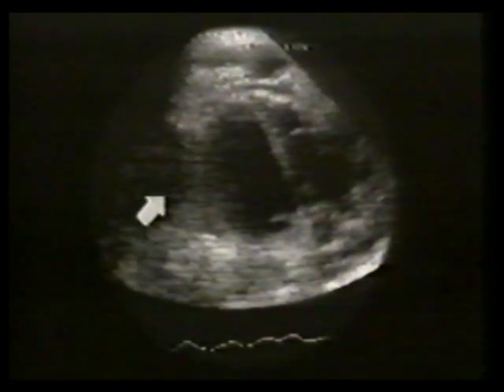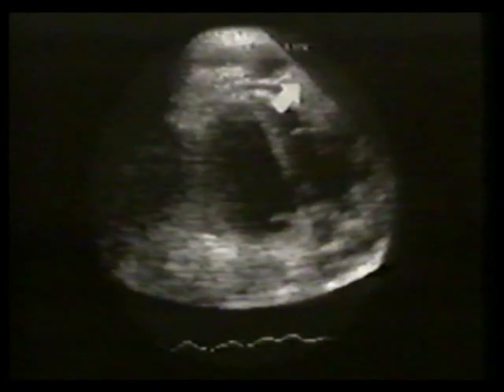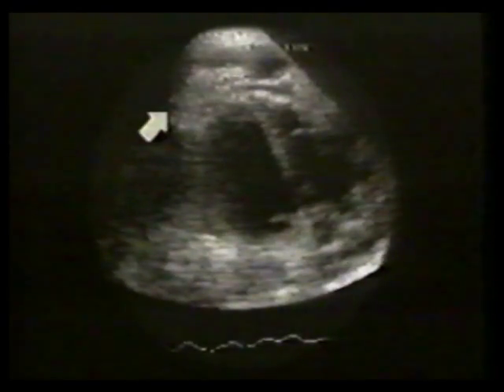This 32-year-old female has a left pleural effusion and a small pericardial effusion. Whenever pericardial effusion is identified, it is important to inspect the pericardial space and the pericardial surfaces for masses. This patient has several large masses attached to the parietal pericardium. These were due to Hodgkin's disease.